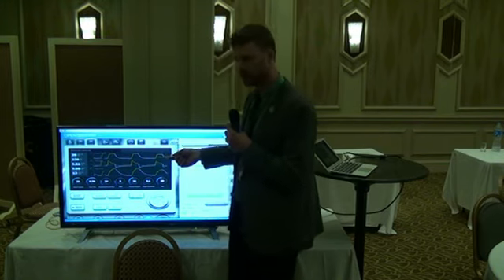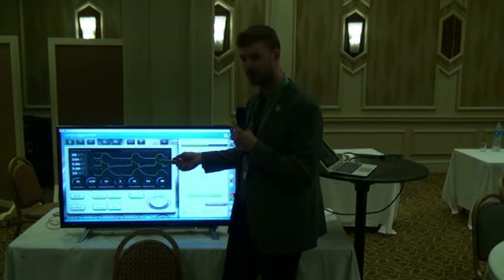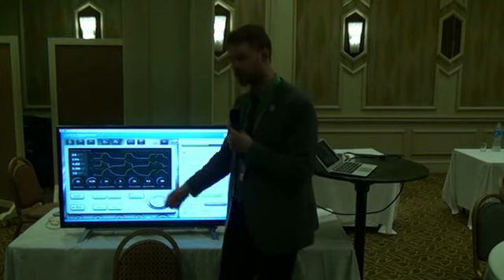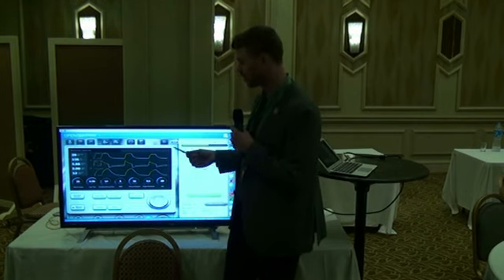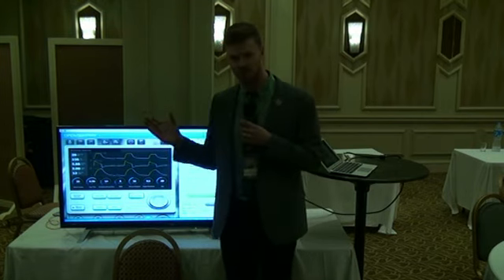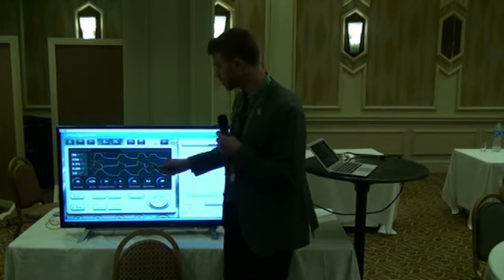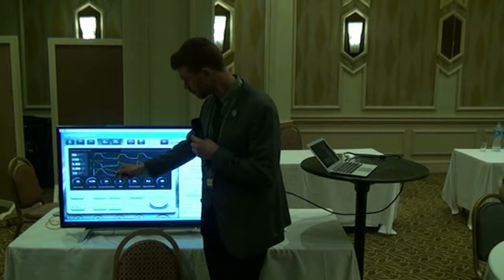But this is obviously a kid with asthma. We probably don't want to increase the inspiratory time. We probably want to do the opposite. If anything, probably reduce it a little bit to increase expiration, because positive pressure ventilation, man, we can do so much work to force that breath in, but we just have to sit back on our hands and wait for it to come out. So during exhalation, we have the same problem.